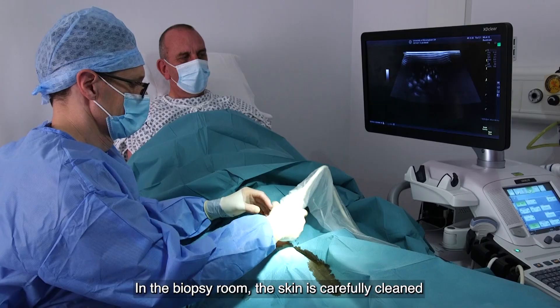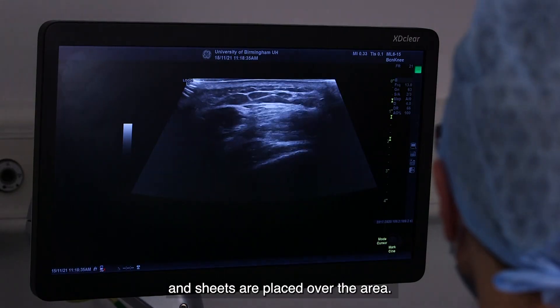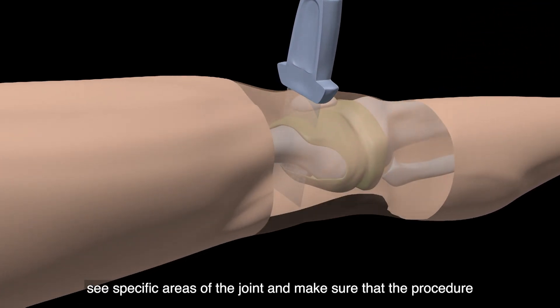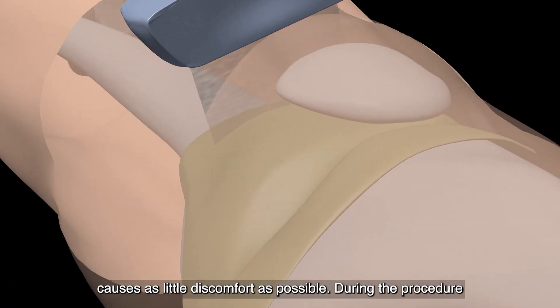In the biopsy room, the skin is carefully cleaned and sheets are placed over the area. Using an ultrasound scanner helps the team to clearly see specific areas of the joint and make sure that the procedure causes as little discomfort as possible.